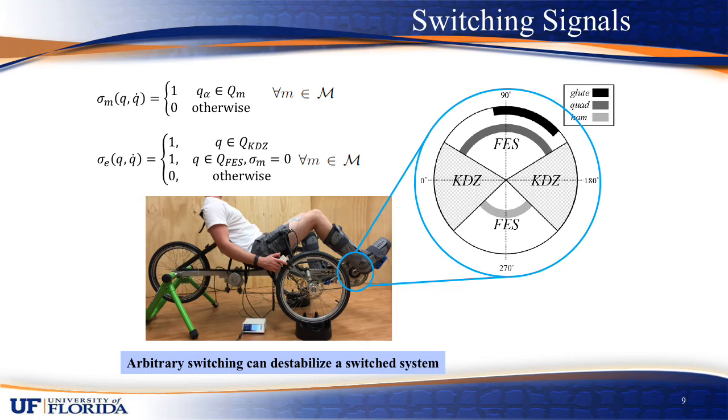However, since the delay is not negligible, the above switching conditions were designed to adjust the activation and deactivation of the motor and FES to compensate for the delay. Now let's look at a few examples.